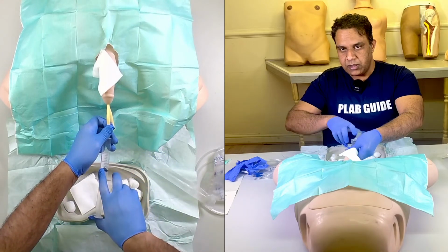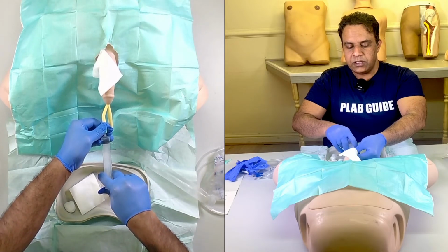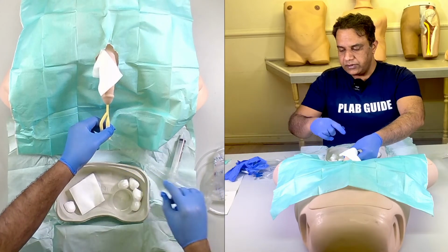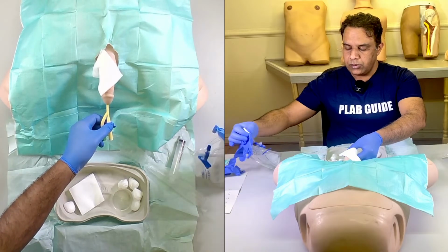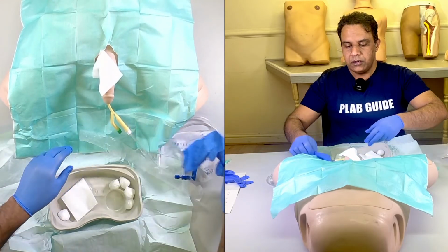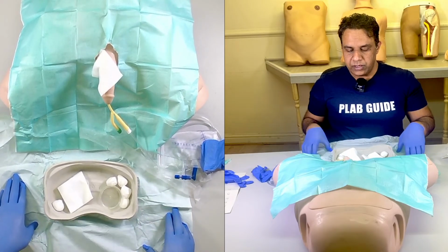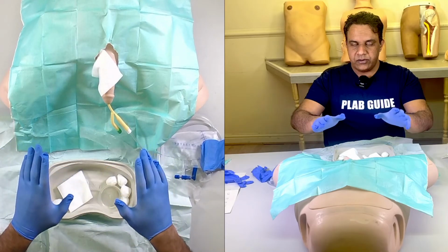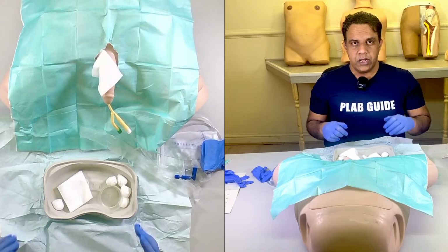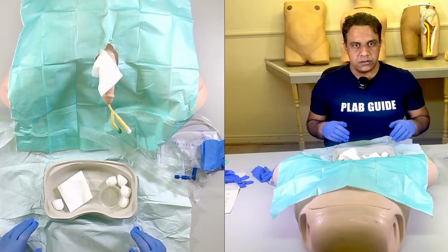After you've seen the urine coming out, push the flush in so that it remains inside. And now, connect it to the catheter, and then clean all your waste and throw it in the waste bin. That's all about it. After you've done this, go and document the procedure in the patient's notes and make sure that you also send a urine sample to the laboratory for the microscopy and culture sensitivity. Thank you.